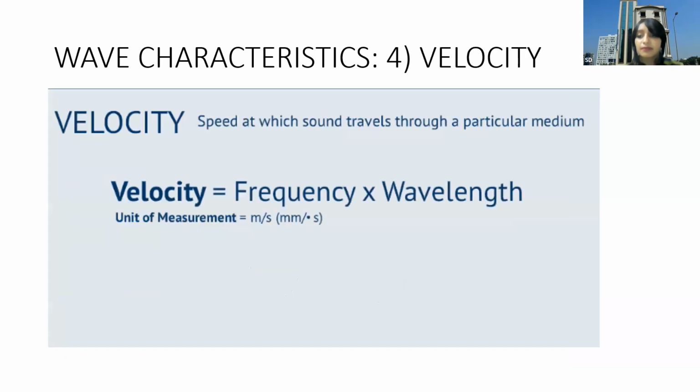Next is the velocity. Velocity is the speed at which the sound wave travels through a particular medium. The unit of measurement is meters per second. Velocity is frequency multiplied by wavelength.